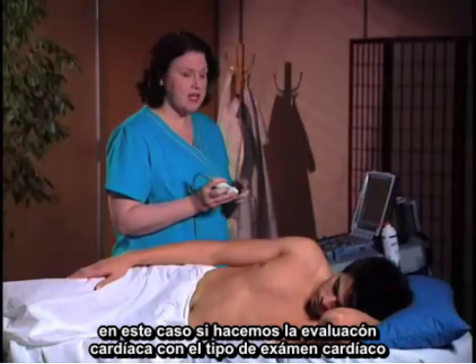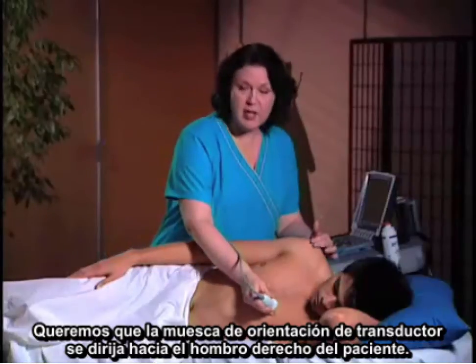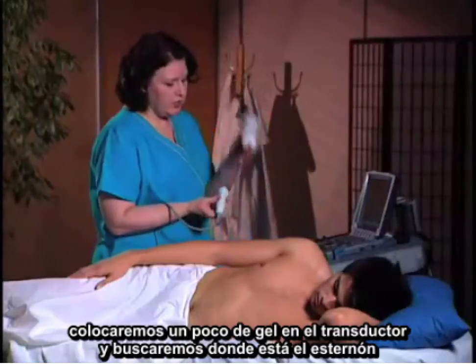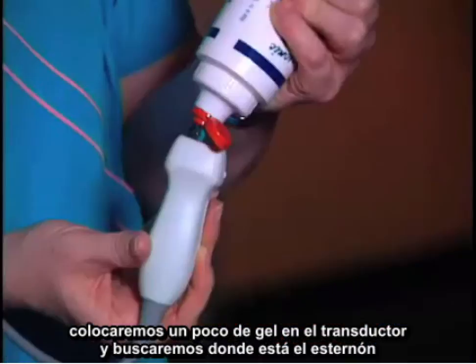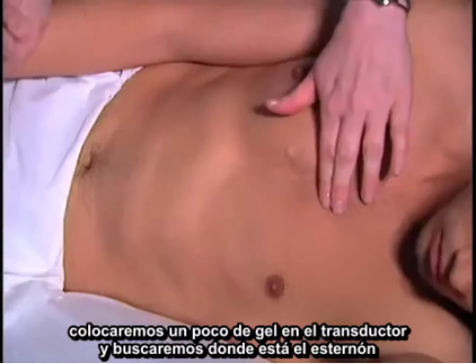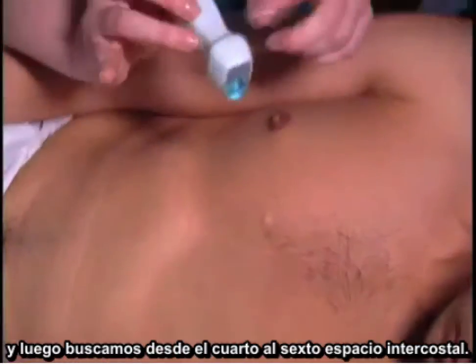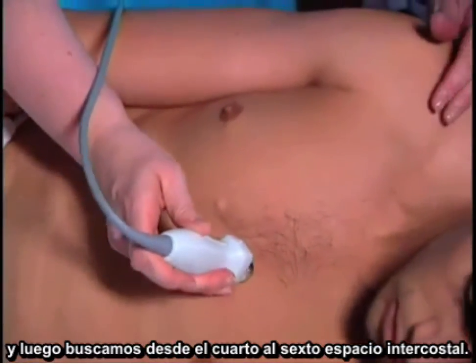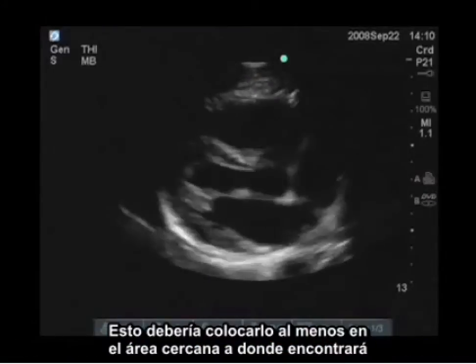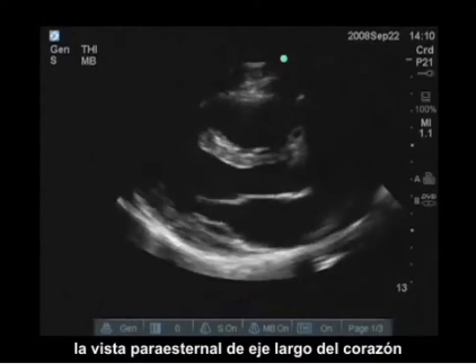If we're doing a cardiac examination with a cardiac exam type, we want the orientation marker facing up to the patient's right shoulder. Once we have the orientation figured out, we're going to put a little bit of gel on the transducer, find where the sternum is, move just a little bit left of the sternum, looking for the 4th to 6th intercostal space. That should put you in the ballpark area for the parasternal long axis view of the heart.